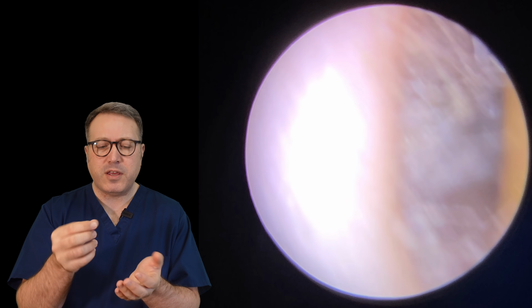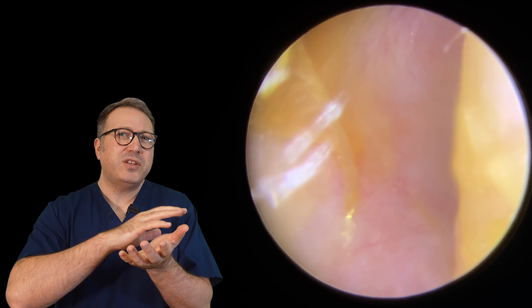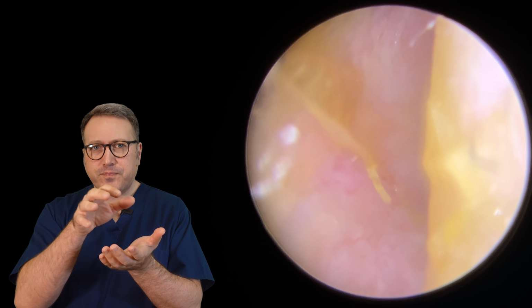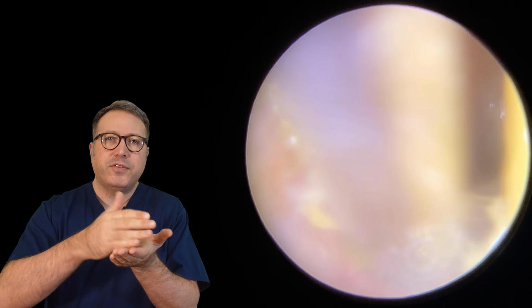So we're going to switch now to the fine end. We're going to get a grip on this skin. And what you'll see is as we lift, you'll see the loose flap of skin come away. But it reaches a point where it just won't budge further than that. Now that's where it meets the healthy skin that's still attached.